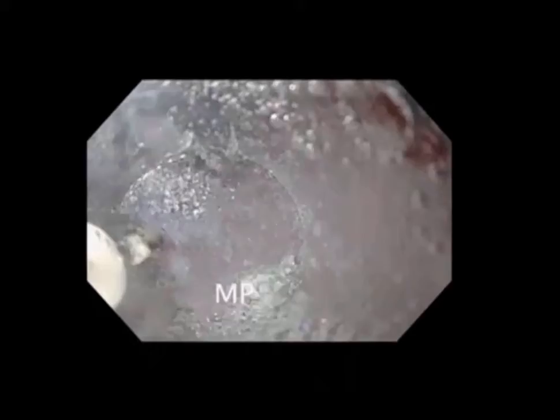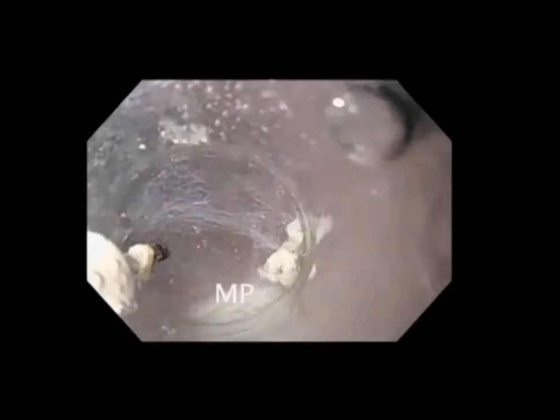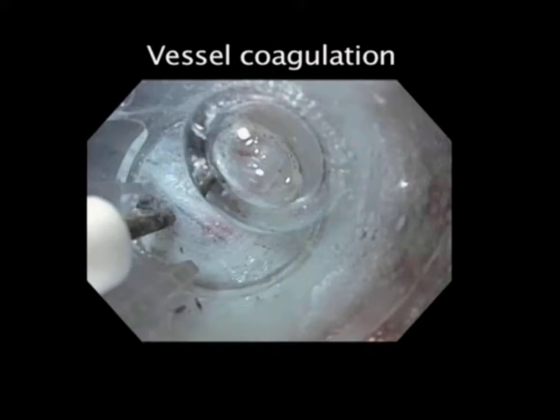We intermittently inject to expand the space and stay just above the muscularis propria layer — this is our dissection plane. We can wash away any bubbles with infusion of water using the water pump. Here you can see very nicely the bands of the circular muscularis propria at the bottom. When we identify vessels, we prophylactically coagulate these.